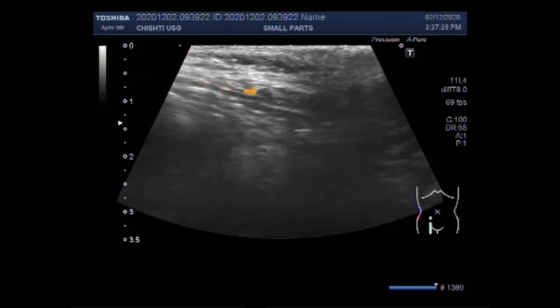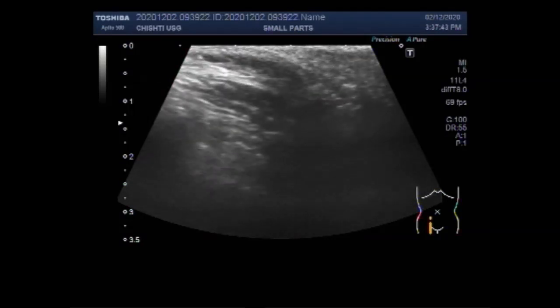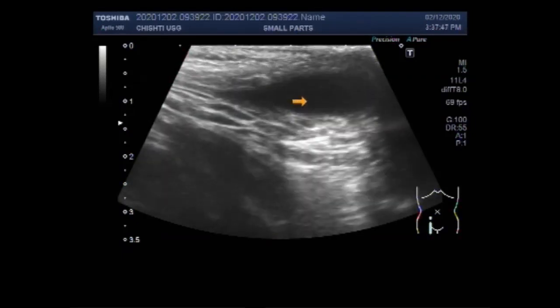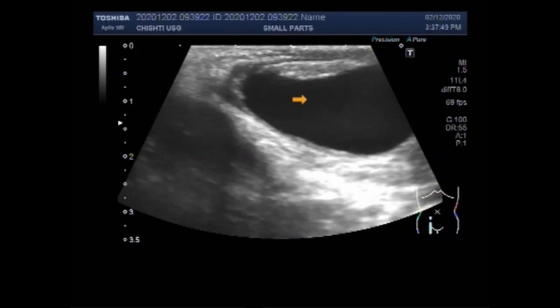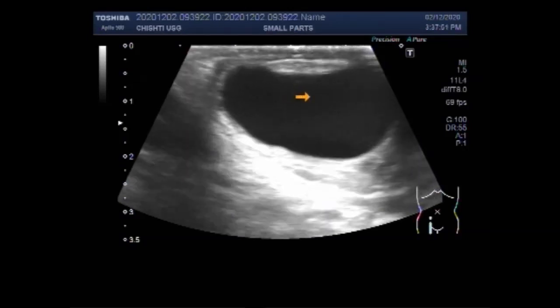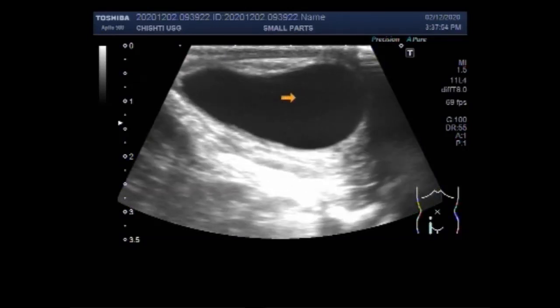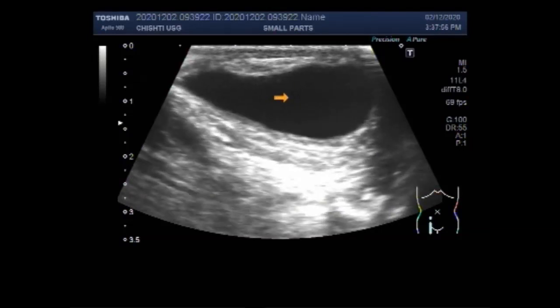Now this is the inguinal canal, and you can see as it approaches the scrotum, a significant amount of fluid collection is seen. This is the fluid collection.